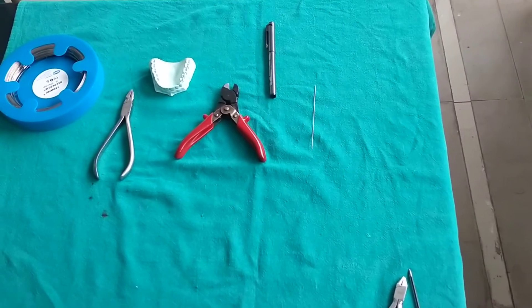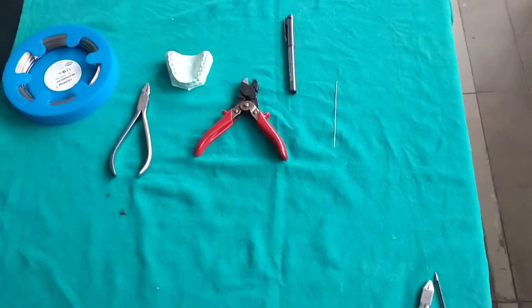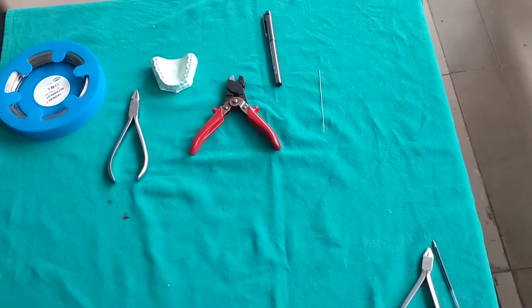In this video, we are fabricating a U-clasp. For that, we need a 0.7 mm stainless steel wire, cutter, universal plier, and marker.